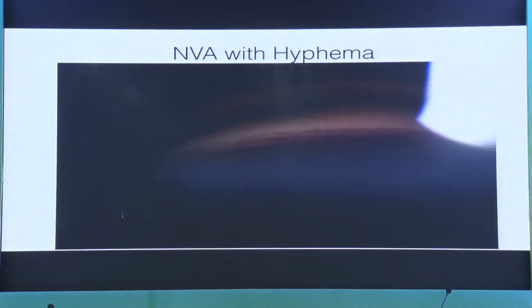This is one very interesting patient. The patient came on the first visit. When we saw the patient, the IOP was about 40 to 45. I couldn't do proper gonioscopy because of the corneal edema. When the patient, a woman, came back again and we did the gonioscopy, this is the finding.